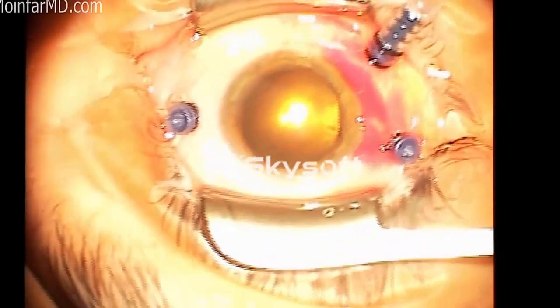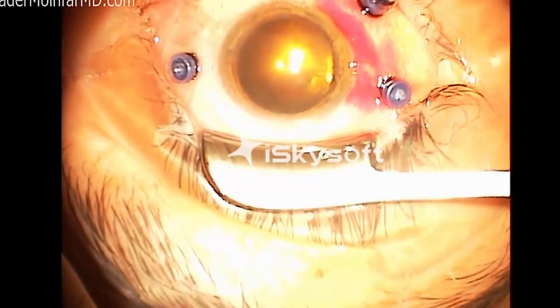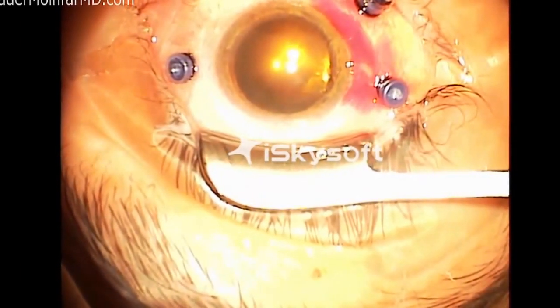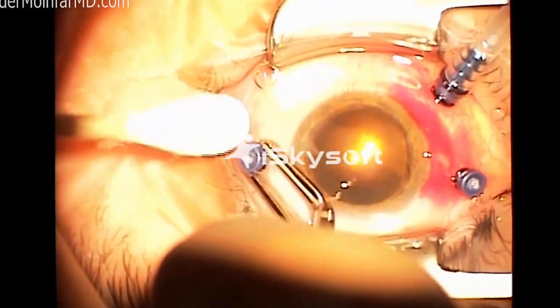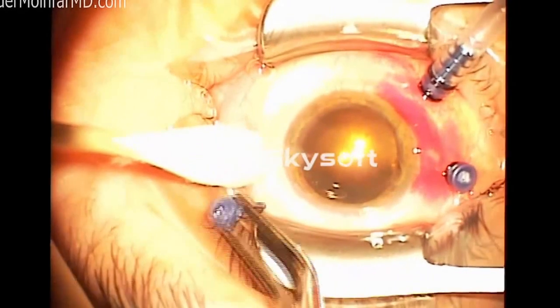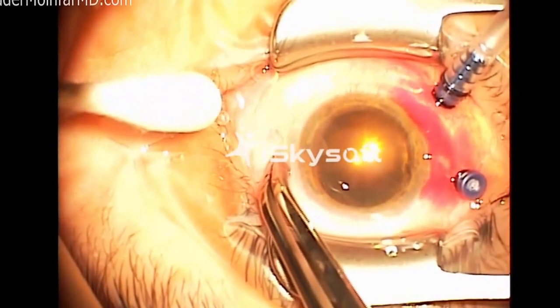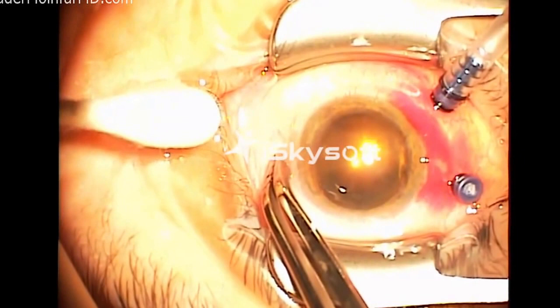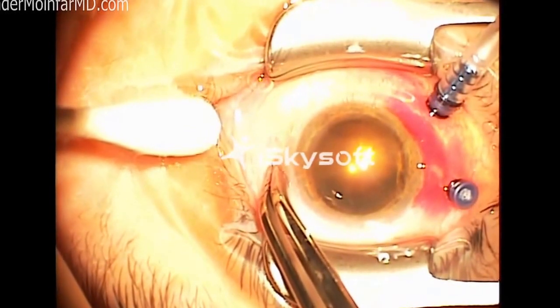What you're going to see me do now is that circular thing is going to come out of the way. That's the lens. We don't need that anymore. And one by one, I'll be removing those little blue things, which are the caps to the cannulas. They just come out in one pull, usually. Sometimes a little bit of manipulation, and then I'll use a Q-tip first to put some pressure on it. Then I'll use the end of these heavy forceps to try to reoppose the edges of the wounds just to make sure that there's no leakage. So I'm just going to put a little bit of pressure there. I usually hold that for about 30 seconds or 45 seconds. And then direct my attention to the other two cannulas.